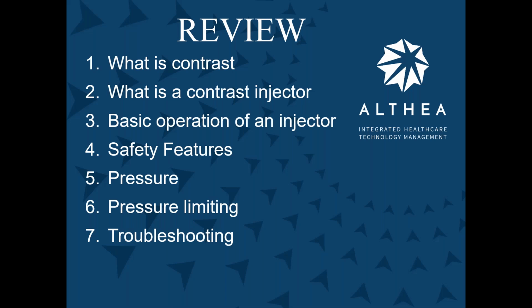Review. Good, we're doing good on time. Contrast, what is contrast? Both are right. Here's the contrast, and contrast is the difference. Shades of gray, shades of gray. What is a contrast injector? Mechanical device.